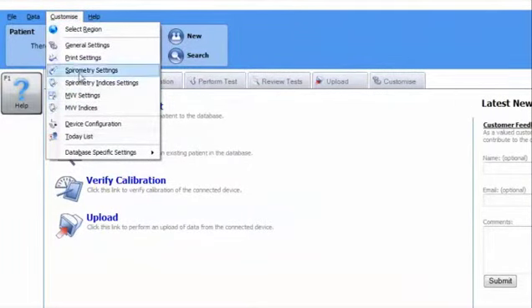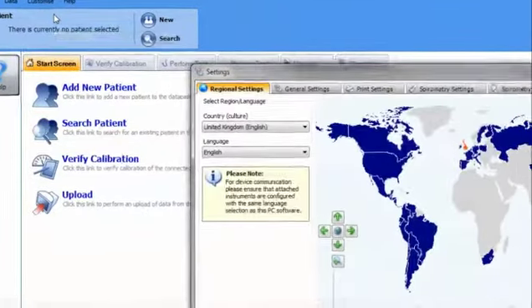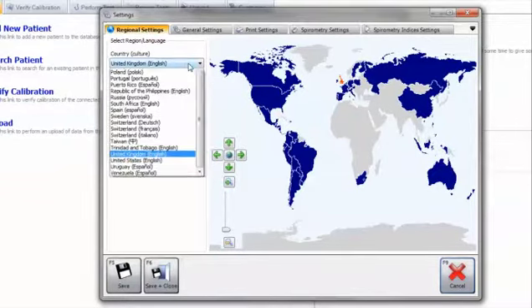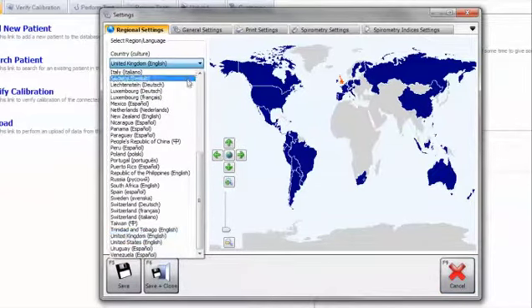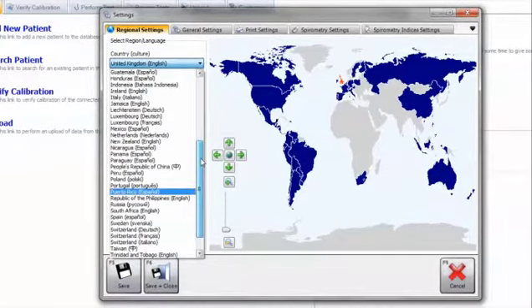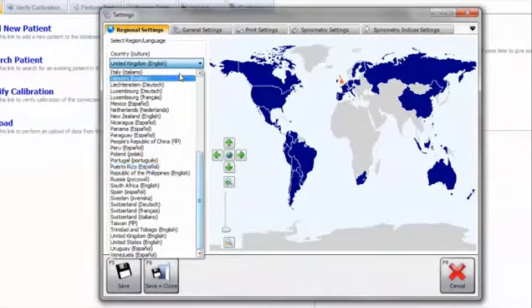During installation, the geographical region will be displayed. Alternatively, during customization, select the option Select Region. As a consequence, the regional settings screen will be displayed. This screen allows you to select the region and language settings. By clicking on the drop-down menu, a list of languages and countries will be displayed.